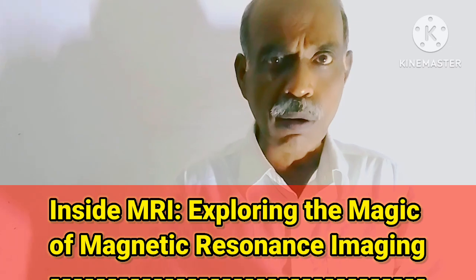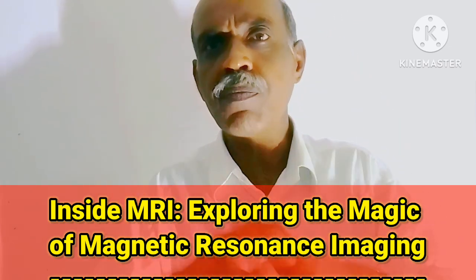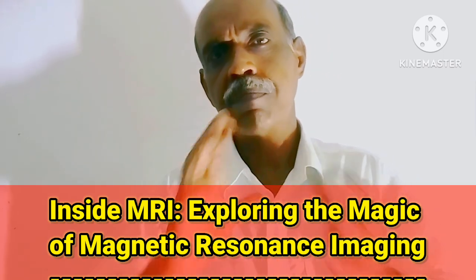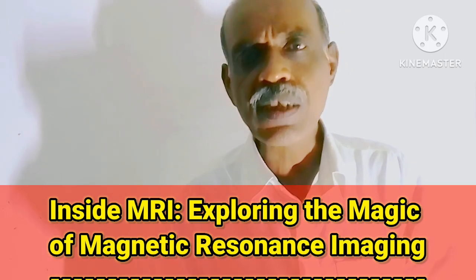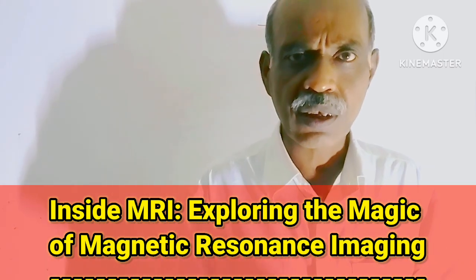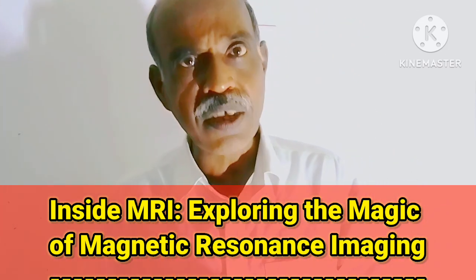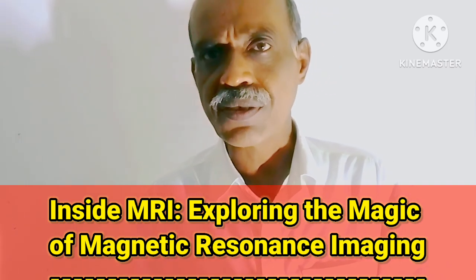Now I am talking about the relaxation, when the radio frequency pulses are turned off. In that case, there is a phase of relaxation of the protons, and during this relaxation phase, due to conservation of energy, the protons emit radio frequency signals.